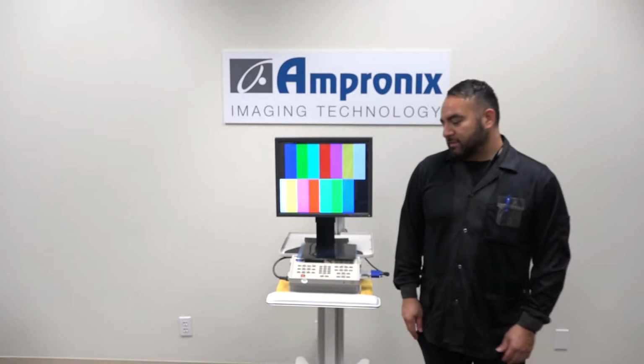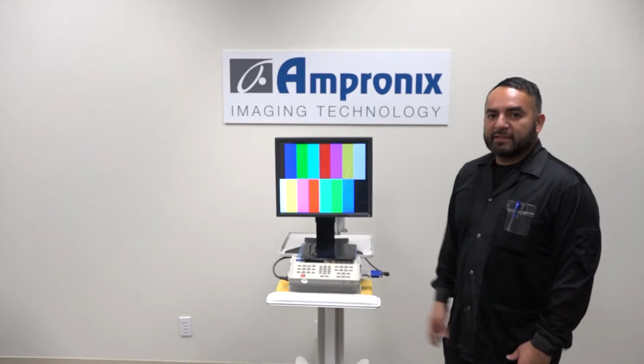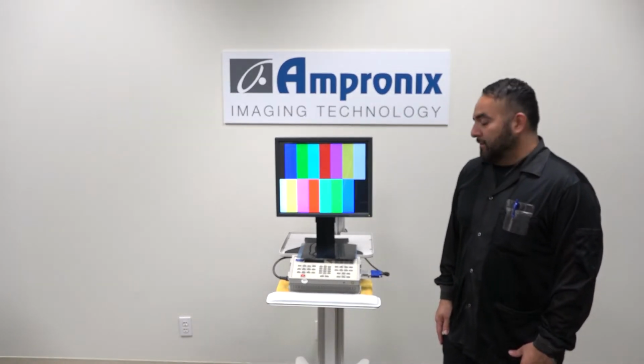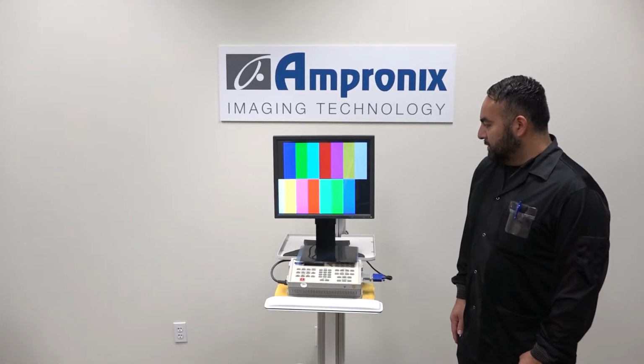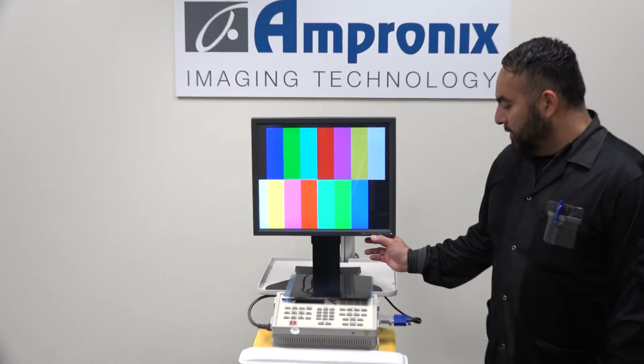And today I'm going to show you guys the different features of the MDT1900 for the G Precision 500 system. With the left arrow, you can access the different types of modes. Right here we have user mode. We push it again, we get DICOM mode.